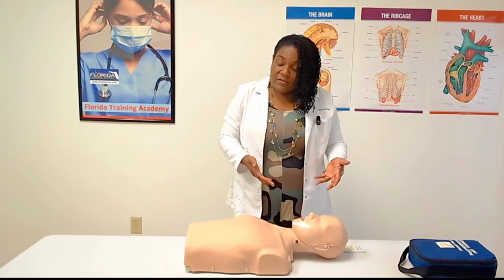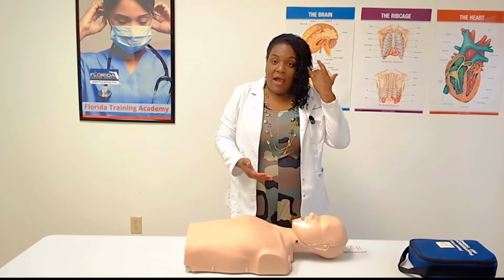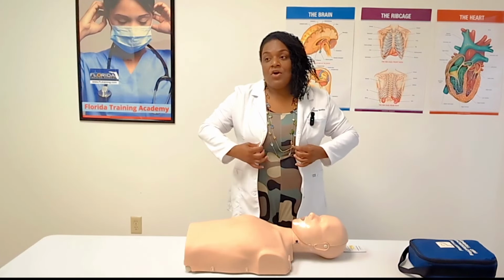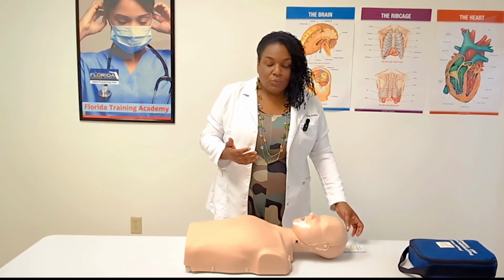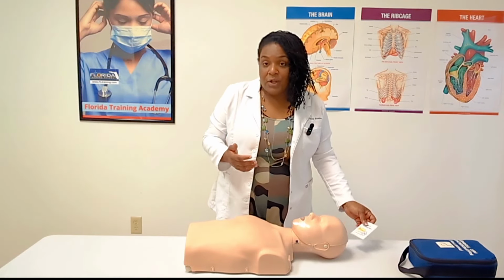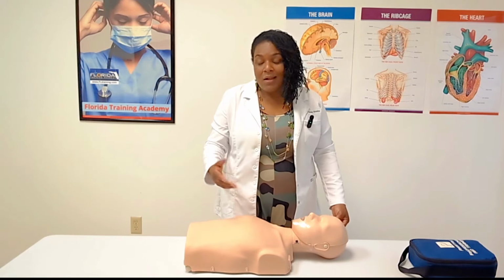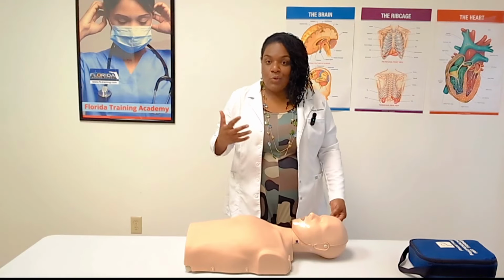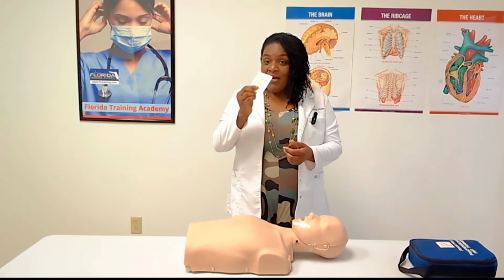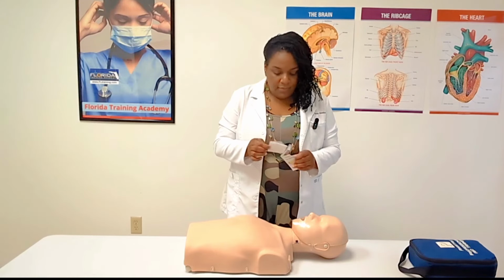If you know this person, you can provide a rescue breath mouth to mouth. However, if this is a patient or someone who you don't know, I wouldn't recommend using your mouth. What you do instead is compression or hands only CPR until those advanced rescuers come or until your teammates come who will have additional equipment. Fortunately, I happen to have a face shield right here.